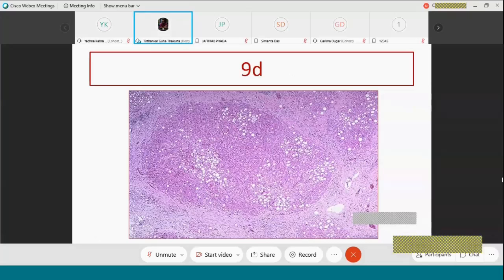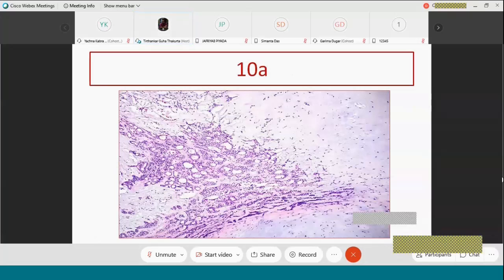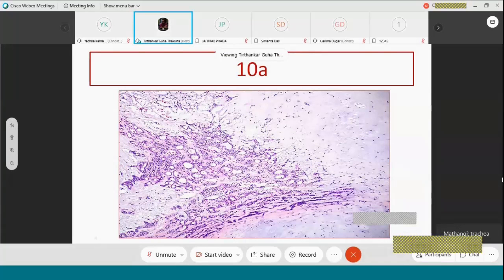So look into this tissue. There are glandular elements, there is a cartilage-like element. What is this that we are dealing with here? If it has to be a trachea, there should be columnar epithelium. There should be bronchiolar structures and smooth muscles. None of them are present here.